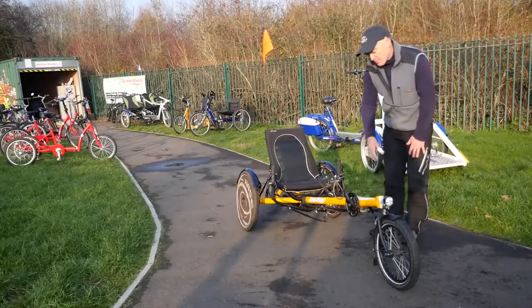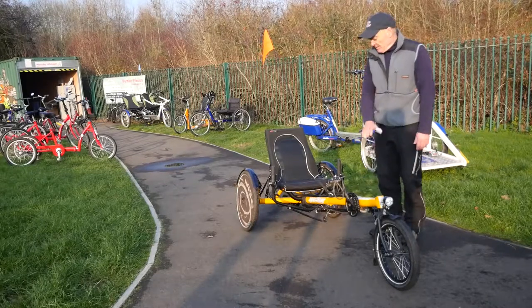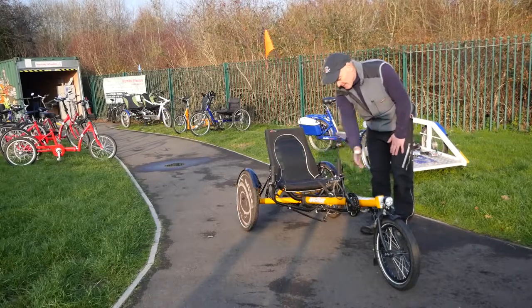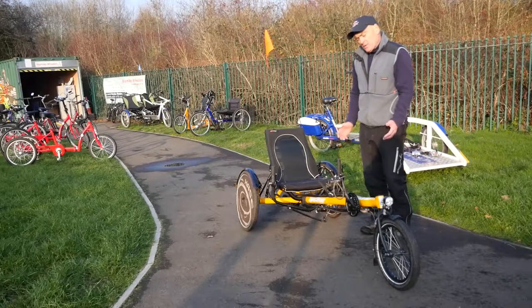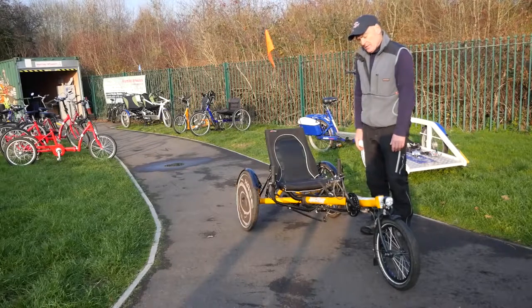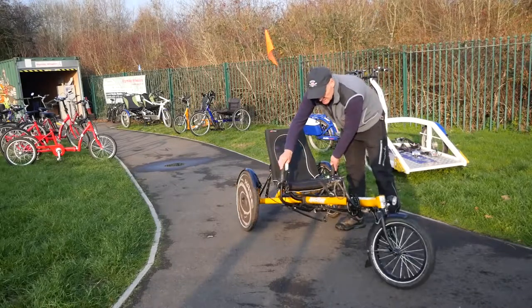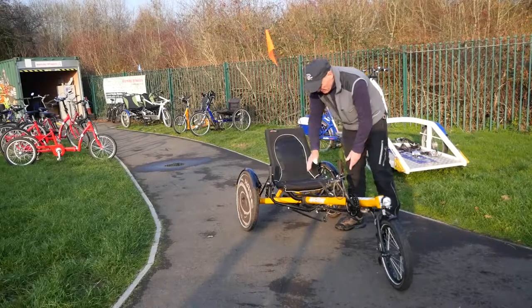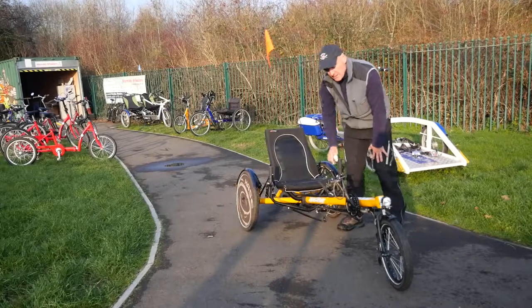These are our recumbent bikes — very different from the bikes you've seen so far because the person is recumbent when sitting down. Their legs are out in front and they're sitting in that seat. They require fairly independent service users with a certain amount of physical capacity. Steering is through the handlebar system, brakes operate separately — one for each wheel — and there are twist grip gears, so it's quite a sophisticated bike.